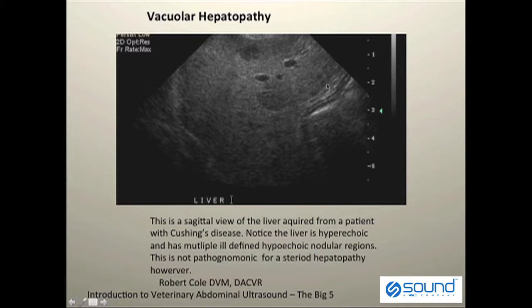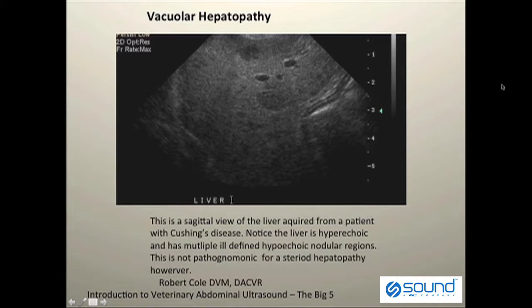The overall size of the liver is also enlarged, as indicated by the rounded borders. Normally the liver should have nice sharp or tapering borders. This is an example of canine Cushing's disease.